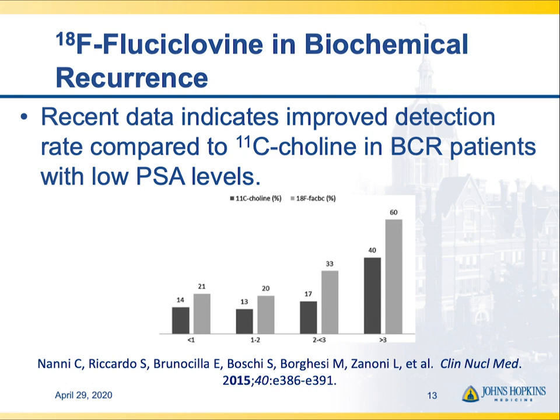There is something in the pipeline, a number of agents that target something called prostate-specific membrane antigen, or PSMA. PSMA has been widely accepted throughout much of Europe and parts of Asia and Australia as the new clinical standard for imaging prostate cancer. And so I expect that once one or more PSMA agents are approved in the U.S., those will really swamp the market in terms of imaging prostate cancer. At least that's my personal opinion, but I think that's shared by most people that do prostate cancer molecular imaging.